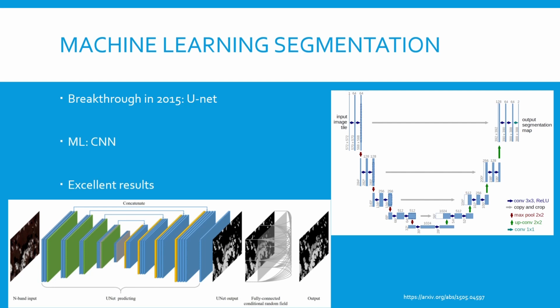The main idea is to supplement a usual contracting network by successive layers, where pooling operations are replaced by upsampling operators. As a result, these layers increase the resolution of the output. On top of that, a successive convolution layer can then learn to assemble a precise output based on this information, helping us accurately segment medical images, which is exactly what we need.